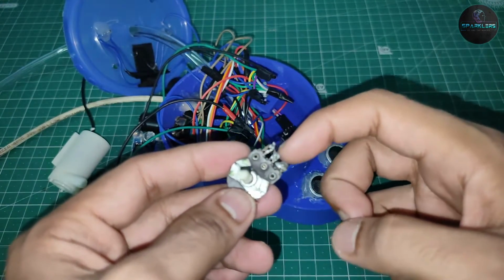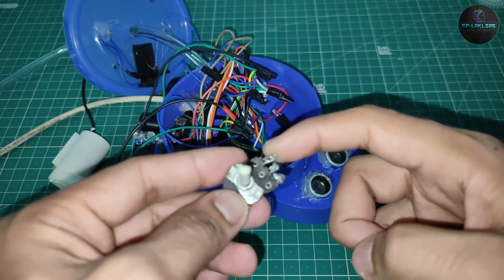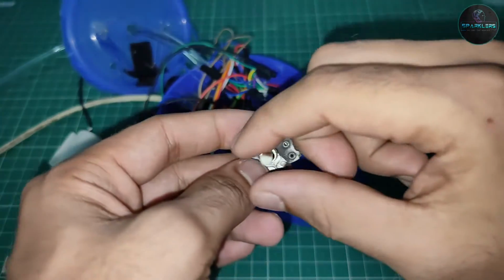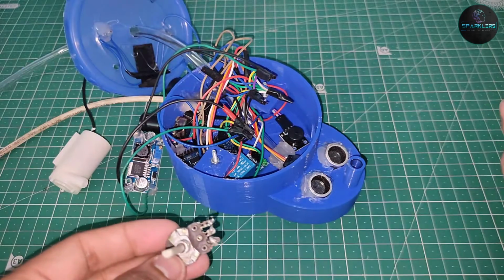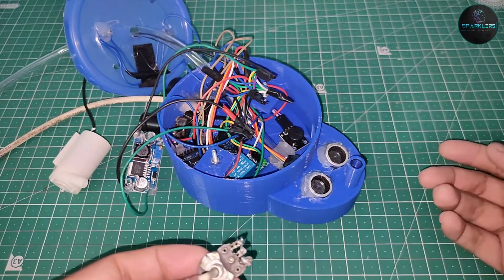There are 2 outer side pins and 1 middle pin. So connect one outer side pin with 5 volts, one outer side pin with ground, and connect the middle pin with any of the analog pins on the Arduino. So what will happen: it is a variable resistor, so whenever you use the knob, it will change its resistance, and the middle pin will give some variable voltage. So our Arduino will take the variable voltage, and then it will get the analog value.